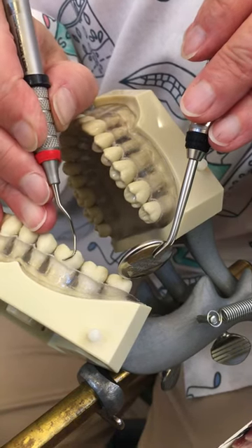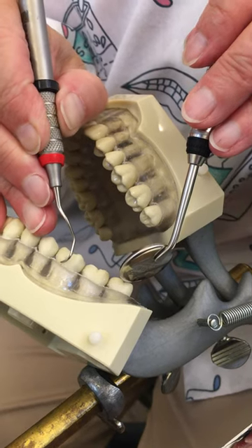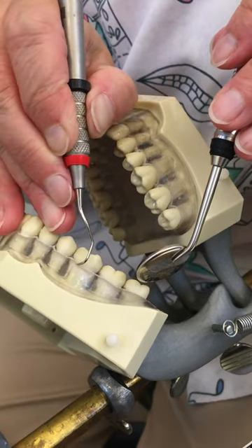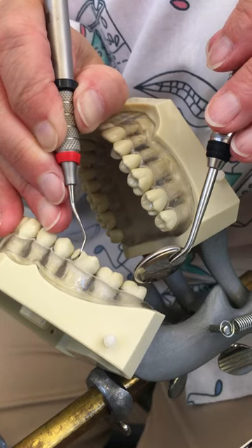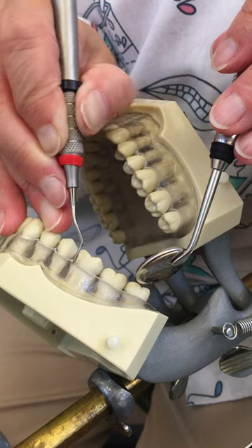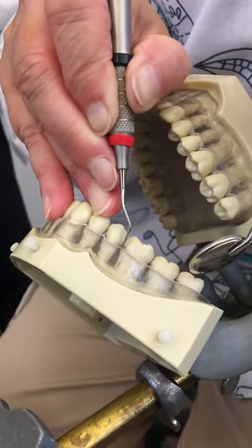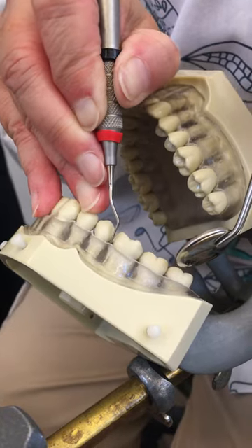So I'm overlapping my strokes using the toe third. Remember: toe to tooth, toe to tooth, toe to tooth — and then rolling every stroke toward the tooth, because your shank is going to tell you what you're working on and what it's doing.